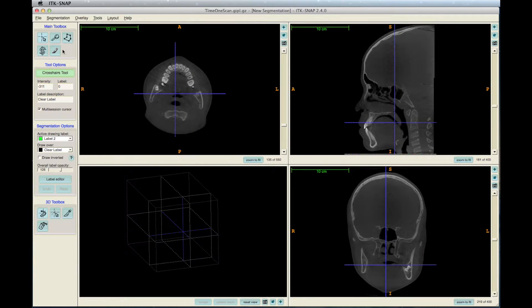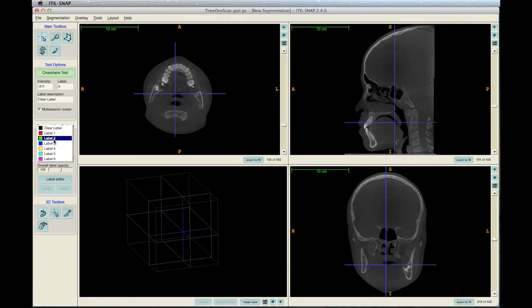In the toolbar on the left there is a segmentation options section. The two drop-down menus here are for the active drawing label, which is the color that your segmentation will be, and the other drop-down menu is called draw over, which is where your segmentation will be created. Active drawing label can be any color — green is the most commonly used for cranial base — and for draw over, select clear label.